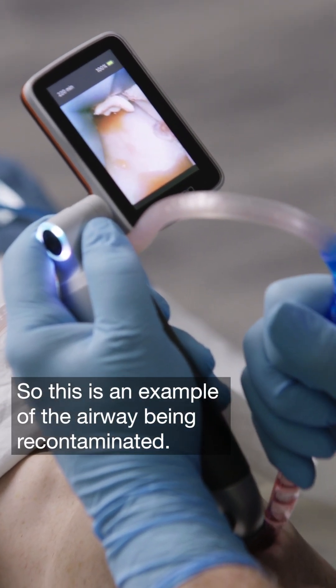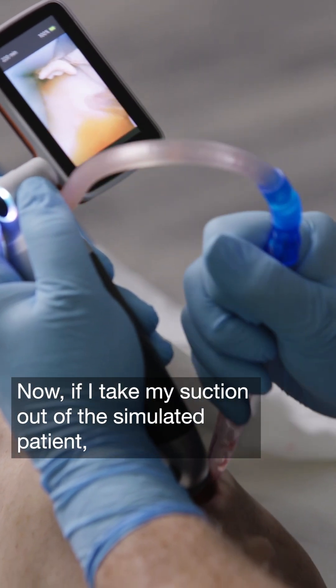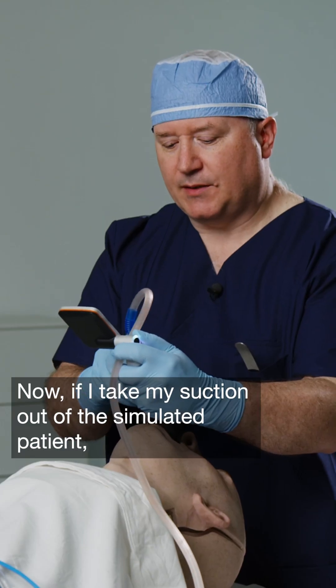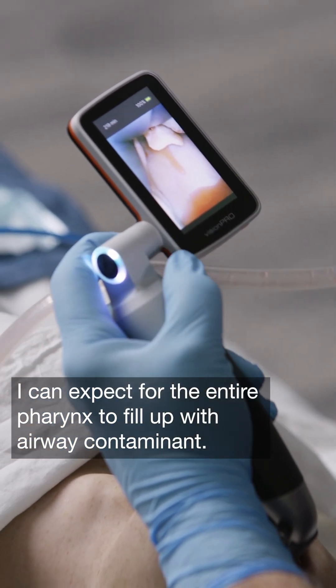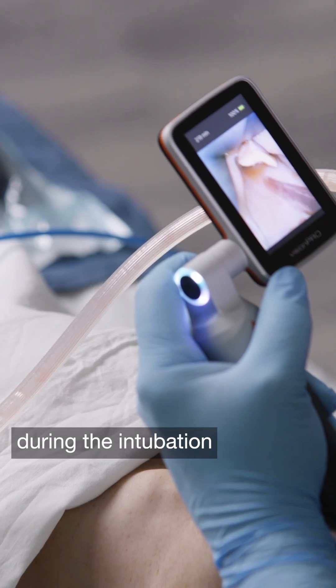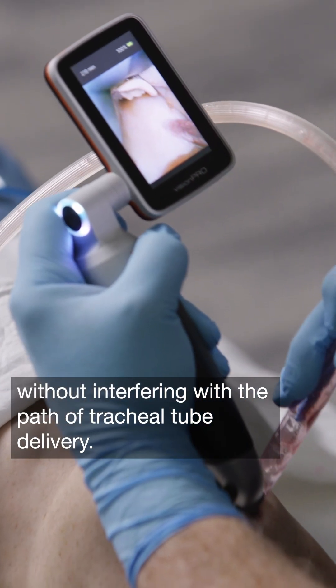So this is an example of the airway being recontaminated. Now if I take my suction out of the simulated patient, I can expect for the entire pharynx to fill up with airway contaminant. So what I'm going to do is I'm going to leave the suction in during the intubation without interfering with the path of tracheal tube delivery.